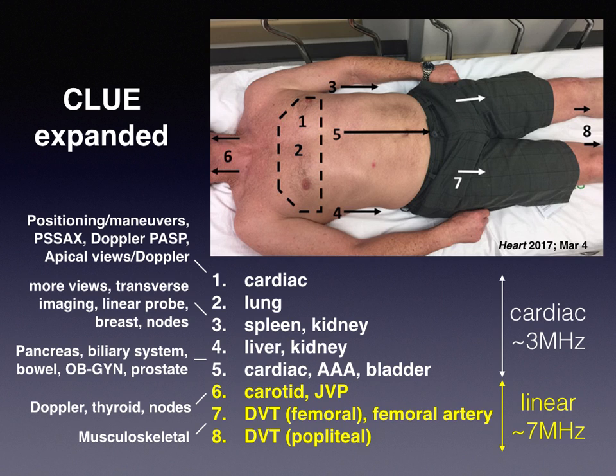Not to be forgotten are the huge gains for the outpatient physician as well in assessing the musculoskeletal system once you have a higher frequency probe. Ultimately, this morphs into a bedside ultrasonic physical examination.